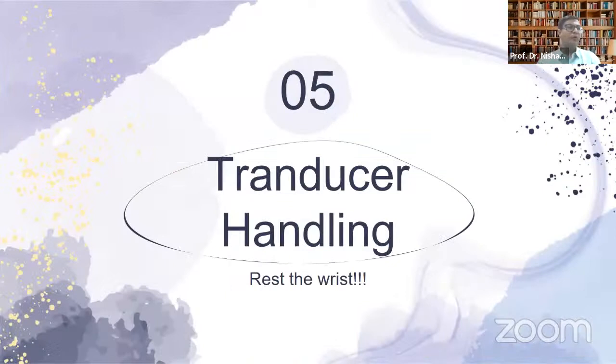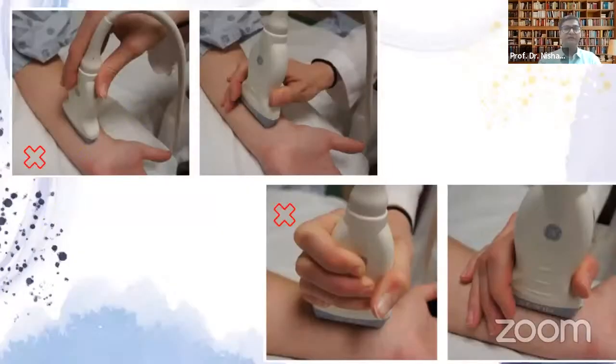Now, how do you hold the transducer? Again, ergonomics. You have to rest your wrist, otherwise you'll end up with carpal tunnel syndrome. You say, okay, fine, I'm not working on the computer, I don't have a desk job. But you're doing a lot of ultrasound work, and if you're not handling the transducer properly, you'll end up with carpal tunnel and wrist pain.